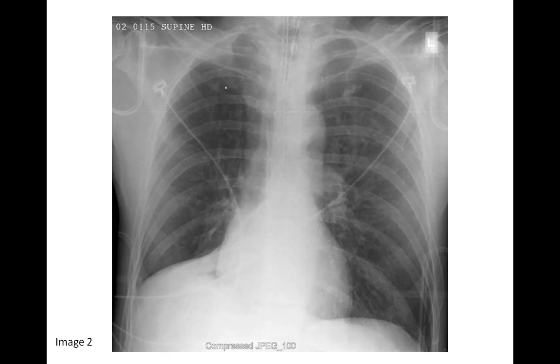This next patient had a significant problem that was underlined in the quiz, a lung problem, and that lung problem is this. That's not hemidiaphragm. Well, part of it is an elevated hemidiaphragm, but that's right lower lobe atelectasis. You know it's in the right lower lobe because you still have a fairly clear right cardiac border. You can see that right heart border, so this tells you that this abnormality is a right lower lobe abnormality.